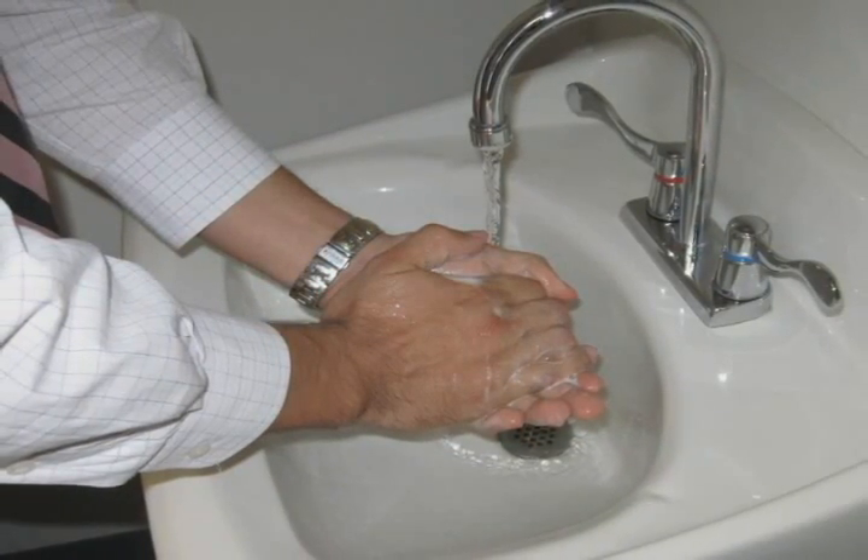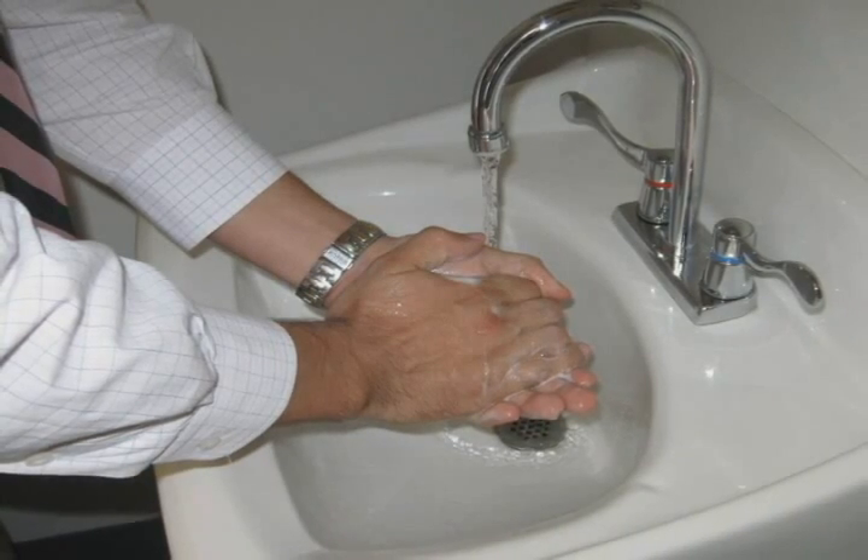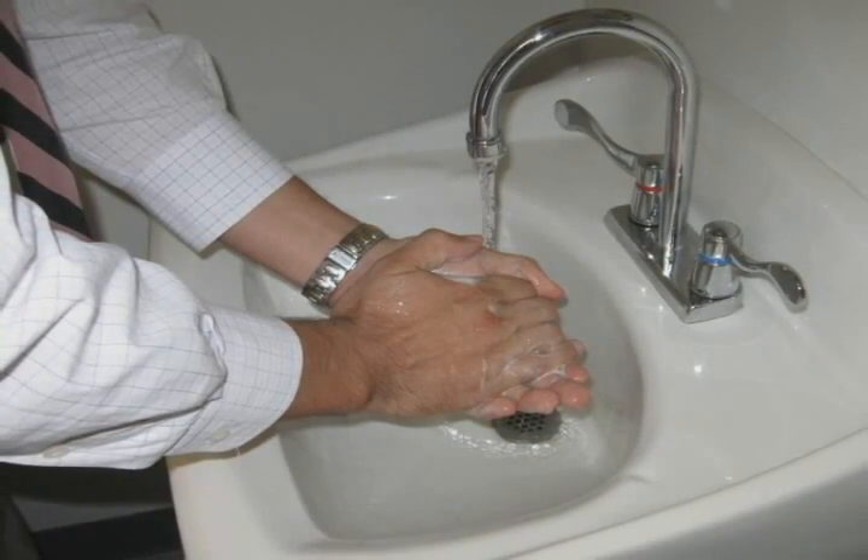Before preparing your insulin dose, thoroughly wash your hands using soap and water. This should be done no matter what type of insulin product you have.